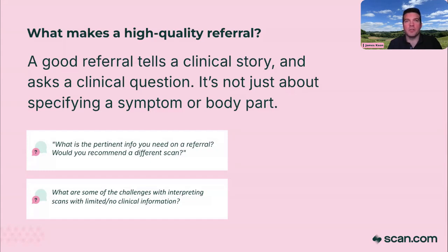Anything that's pertinent to the exam that they're going to have ideally would be communicated to the team that are going to scan that patient. In my experience, everywhere I've ever worked, radiographers are always very, very diligent about that patient safety stuff. So plain film, we're always going to be asking patient safety questions. Similarly with MR, anything that's cardiac pacemaker, injuries, bullet wounds, shrapnel, all of those types of questions, everyone radiographically is always going to ask those questions. So there's such a double safety net there.